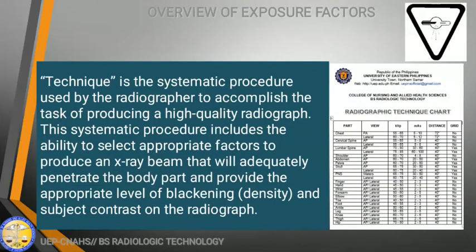Technique is the systematic procedure used by the radiographer to accomplish the task of producing a high-quality radiograph. This systematic procedure includes the ability to select appropriate factors to produce an X-ray beam that will adequately penetrate the body part and provide the appropriate level of blackening, or the density, and the subject contrast on the radiograph. If you look at the operating console of the University of Eastern Philippines, you will notice these radiographic technique charts, because there are many. These were produced by the former BSRT2 students, who have now been promoted to BSRT3. They made radiographic technique factor charts which were personalized. In other words, they made their own techniques.